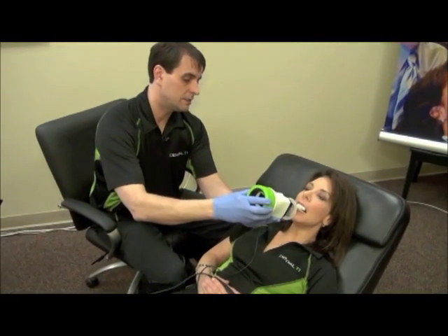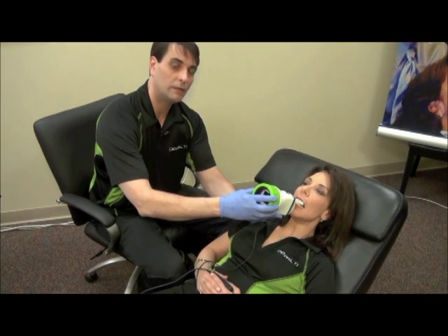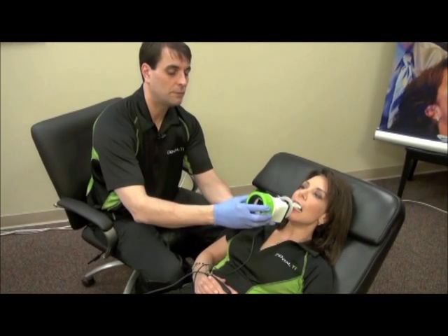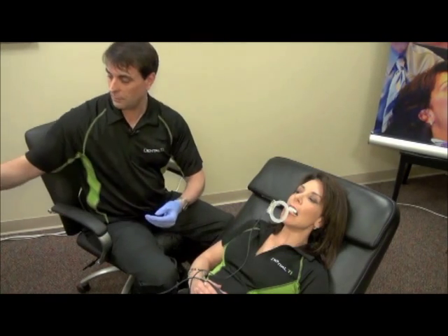Here, technique is the same where you're flush with the ring. If the patient had a shallow palate and you were having a difficult time picking up the apices, you would drop the tube head down and elevate the angle a little bit, and that would allow you to capture the apices.